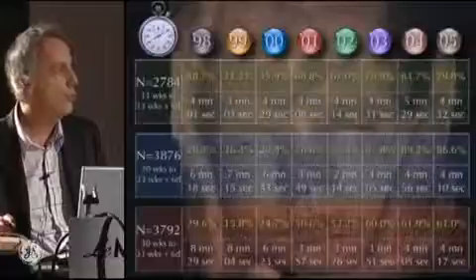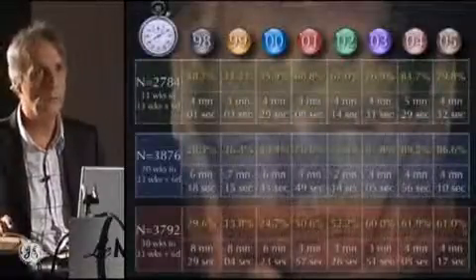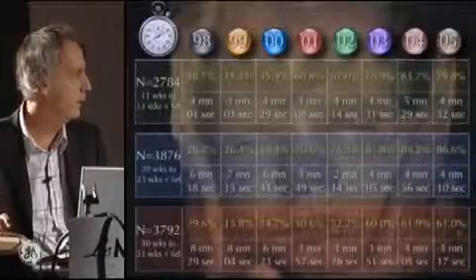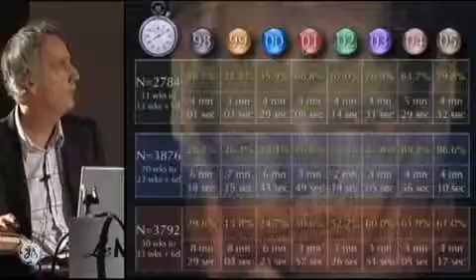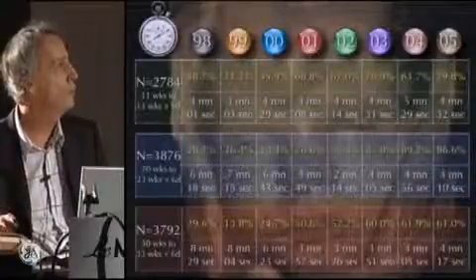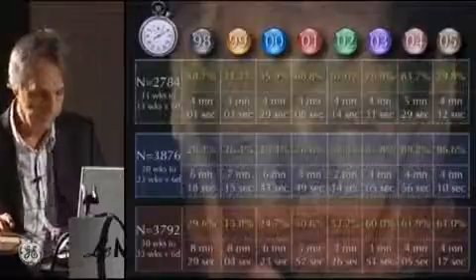And in the third trimester, it's more difficult. Why? Because you have no amniotic fluid around the fetus, and this is really difficult. And the big step was the year 2001. It was the launch of the new system of the 730.